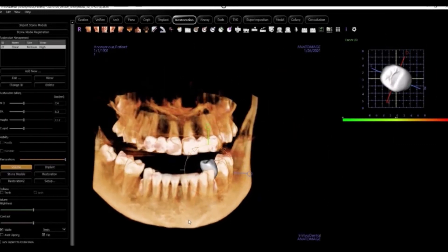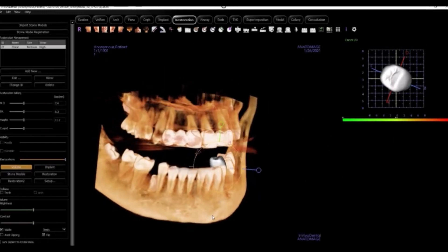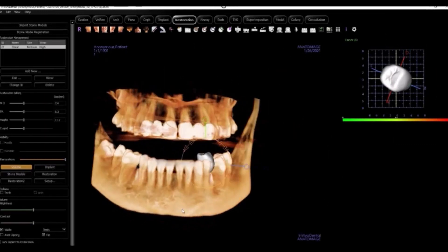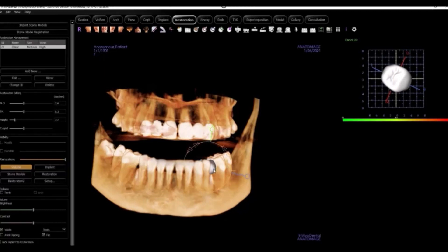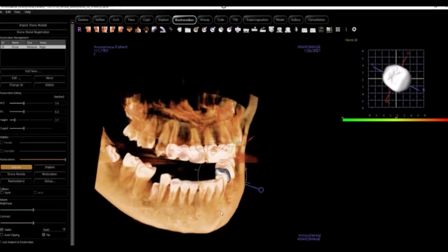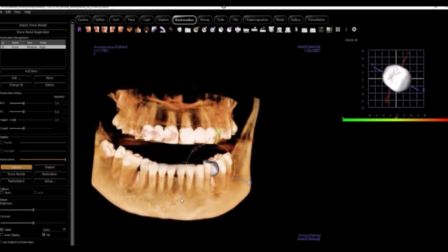As you can see, we have a lot of adjusting to do in order to make this restoration match the patient's anatomy. After some time, you can get this tooth looking decent enough to adjust your implant and present to your patient. This process can traditionally take 2 to 20 minutes.